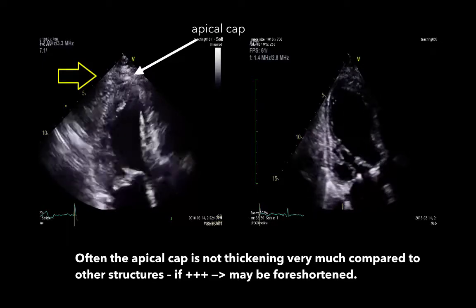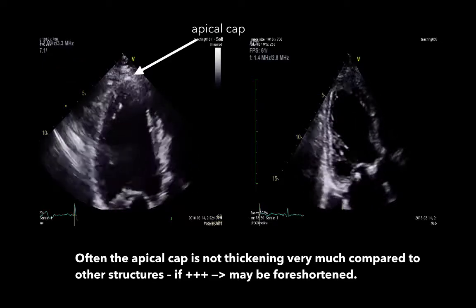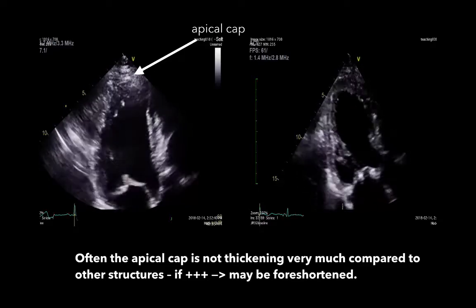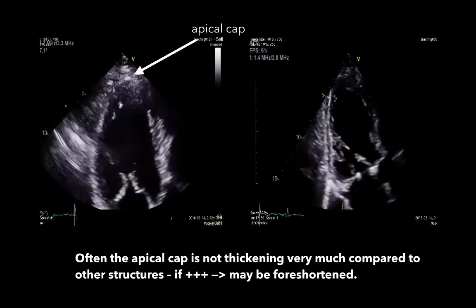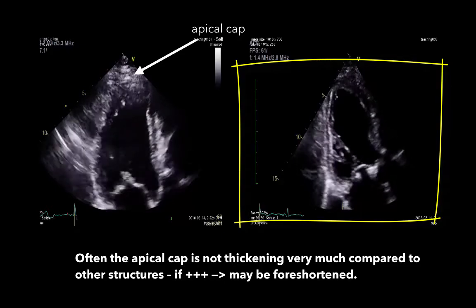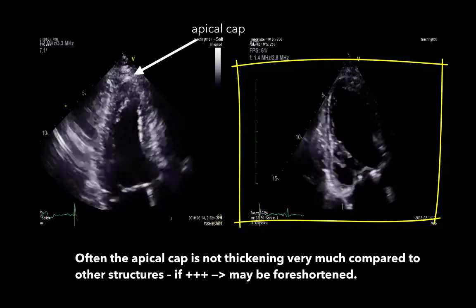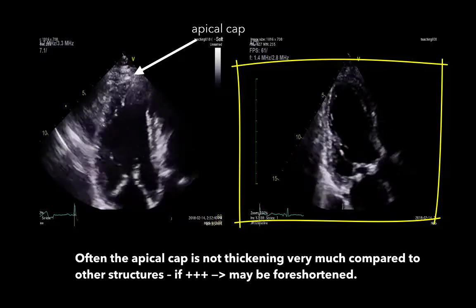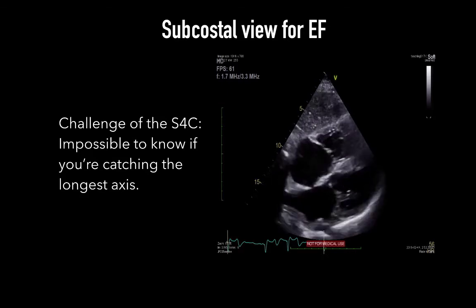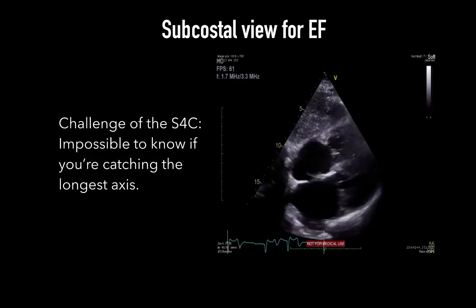The apex should really be the anchor of the heart during an echo assessment, and it should only thicken and not move in space. Its contraction is usually the smallest of all LV segments, and it appears as the thinnest portion of the LV. The right side clip in comparison shows a moving apex and a thickening apex that changes during every contraction. This is not the true apex. Foreshortening is the reason the subcostal four-chamber view can be challenging for LV assessment, because it's really impossible to know whether you're catching the longest axis of the LV.